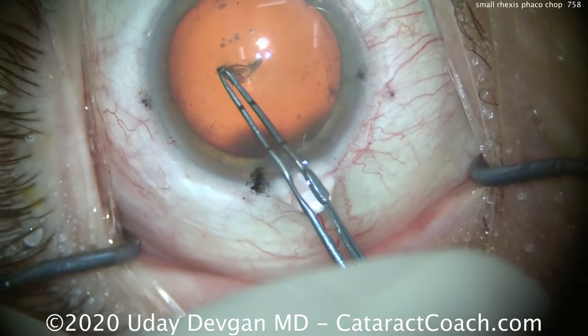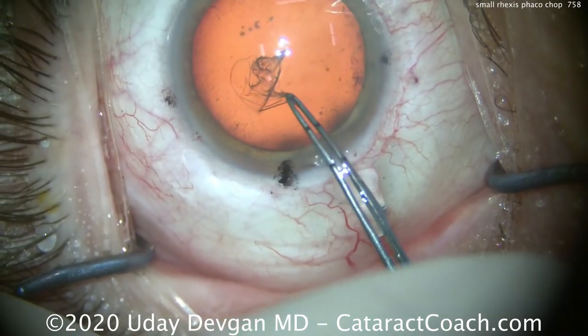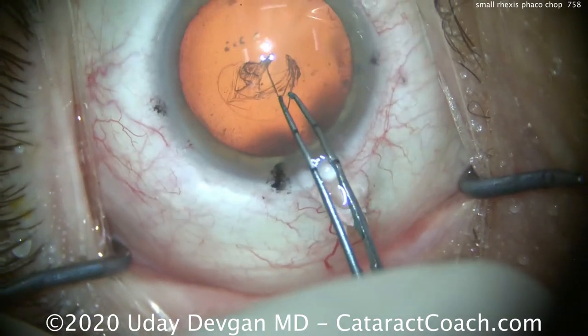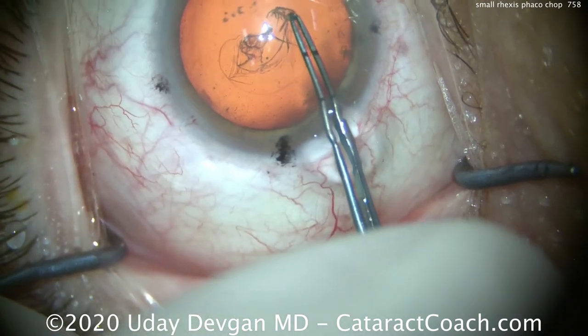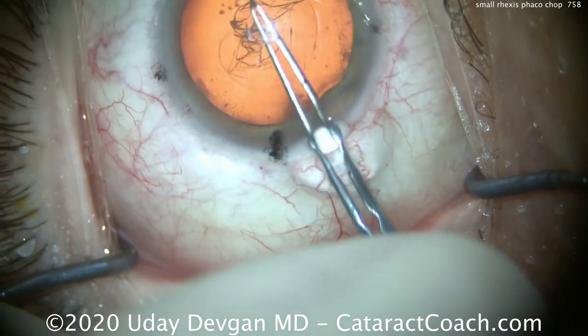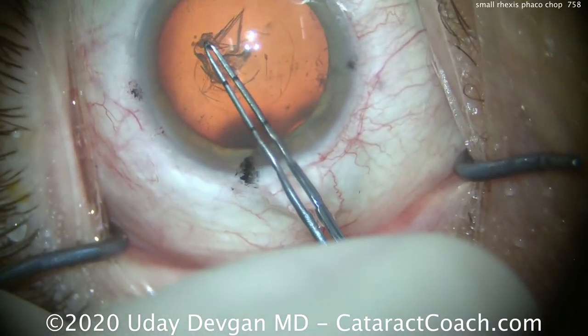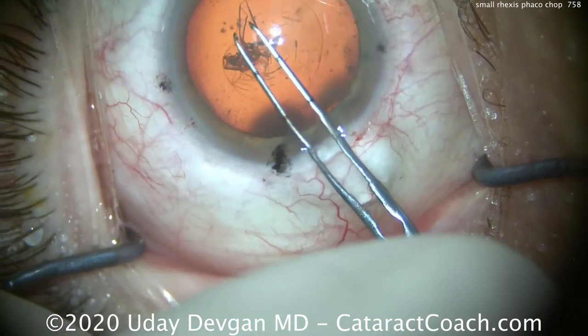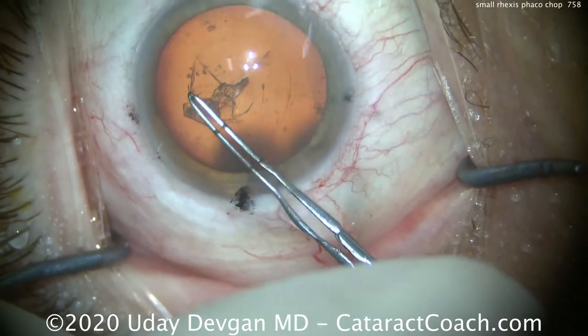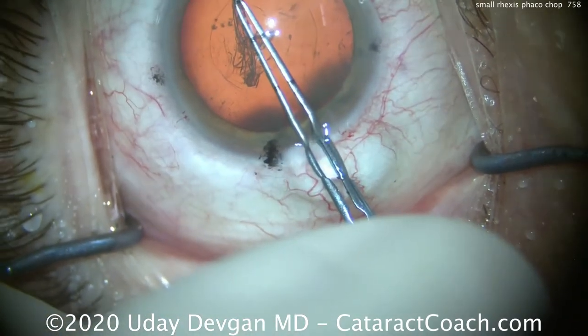It's otherwise a normal phaco. You can see we're starting the capsulorhexis. My forceps are marked off at 2.5 and 5 mm from the tip, and you can do this to your own forceps — simply use a disposable keratome and you can make etchings on the surface. Let's complete the capsulorhexis here and that looks pretty good. At the end we're going to measure it using the forceps and you'll see it's just under 5 mm.